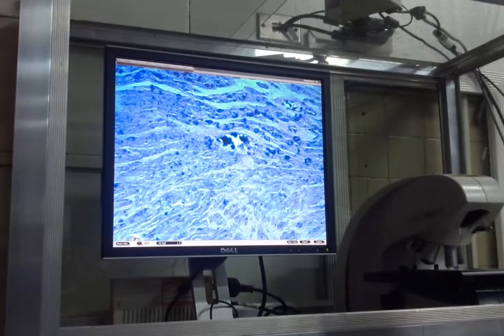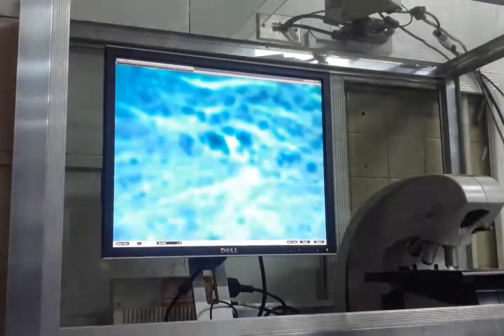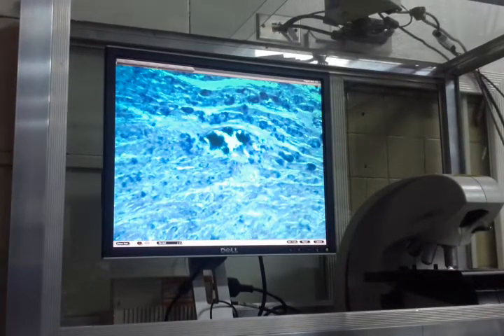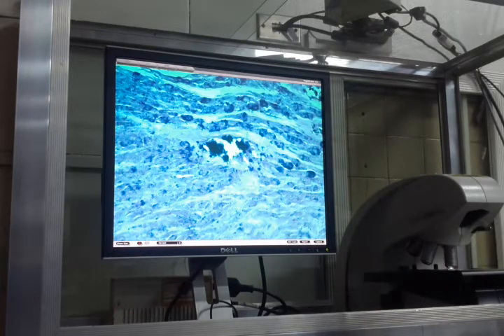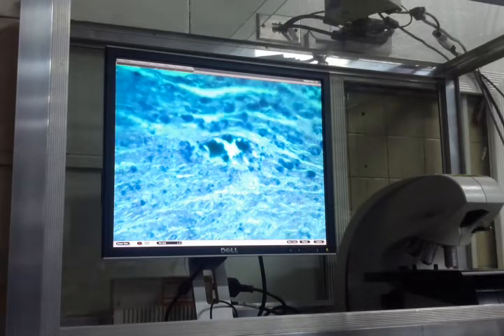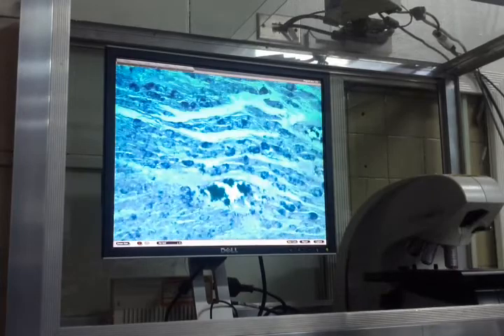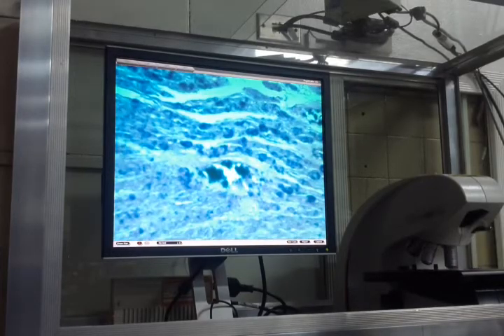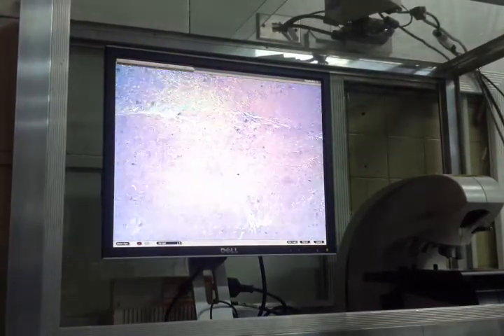That's calcification. Okay? Dystrophic calcification. When will you see it? The dystrophic calcification, which is also a form of cellular injury. In necrotic tissues, correct? Or injured tissues. Tingnan pa natin yung mas malaki. May mas malaki pa dito eh.